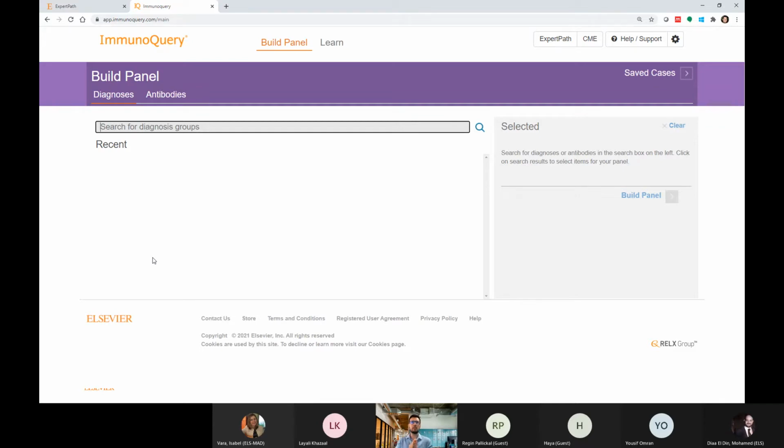And I think the platform can provide us both takes of that question. So either I can say, okay, I have this doubt between these two diagnostics, which markers could I use in an eventual situation where I want to confirm if it's either option A or option B or option C even?